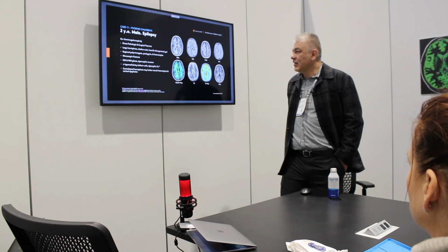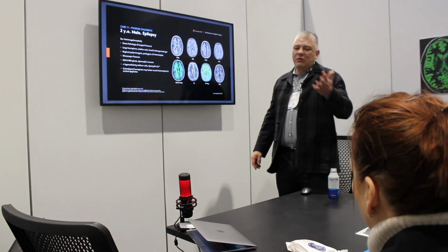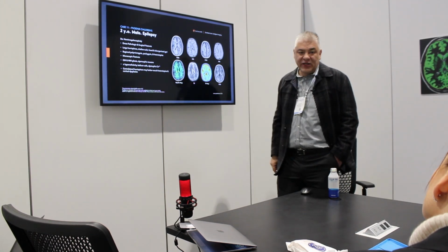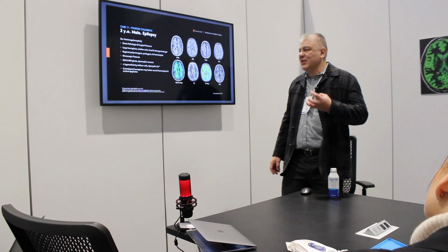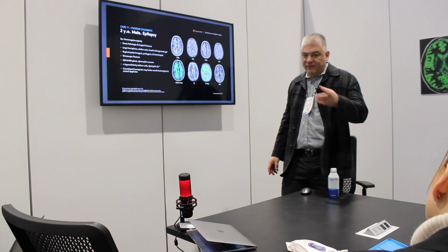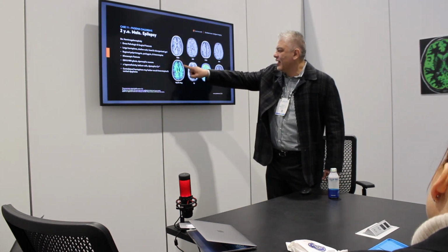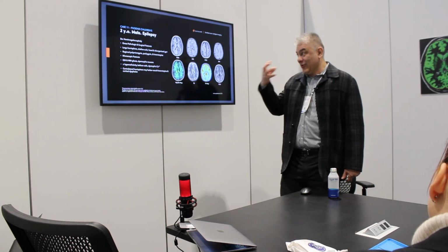So, next. This is a 2-year-old male with epilepsy, obvious case of polymicrogyria, no problem, right? You can go years without knowing that there are other areas, and this tool allows us to see it much quicker, much faster. It gives me a sense of security to have all these additional sequences and maps to be able to say, yeah, there is cortical dysplasia, there is not. And you can also see how there is all this green here around this cortical area, that is not actually on the other side.